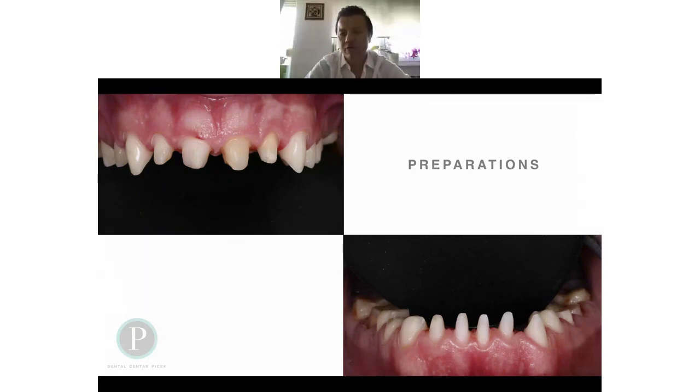We hope so. You are much more sure if you do the butt joint, where your margin will be on the palatal side if you're speaking about the upper jaw, or the lingual side if you speak about the lower jaw.